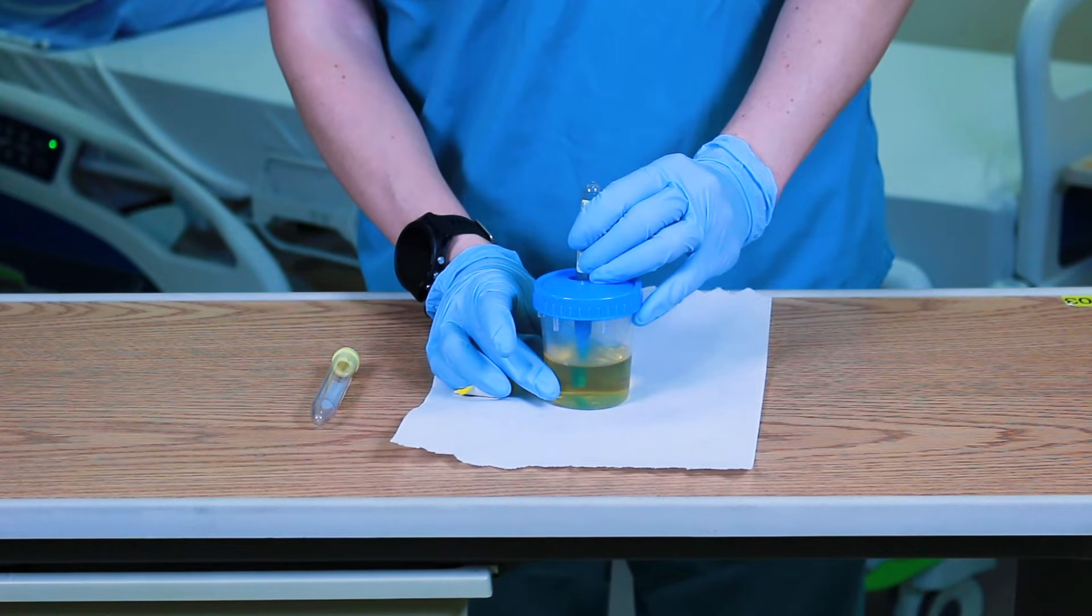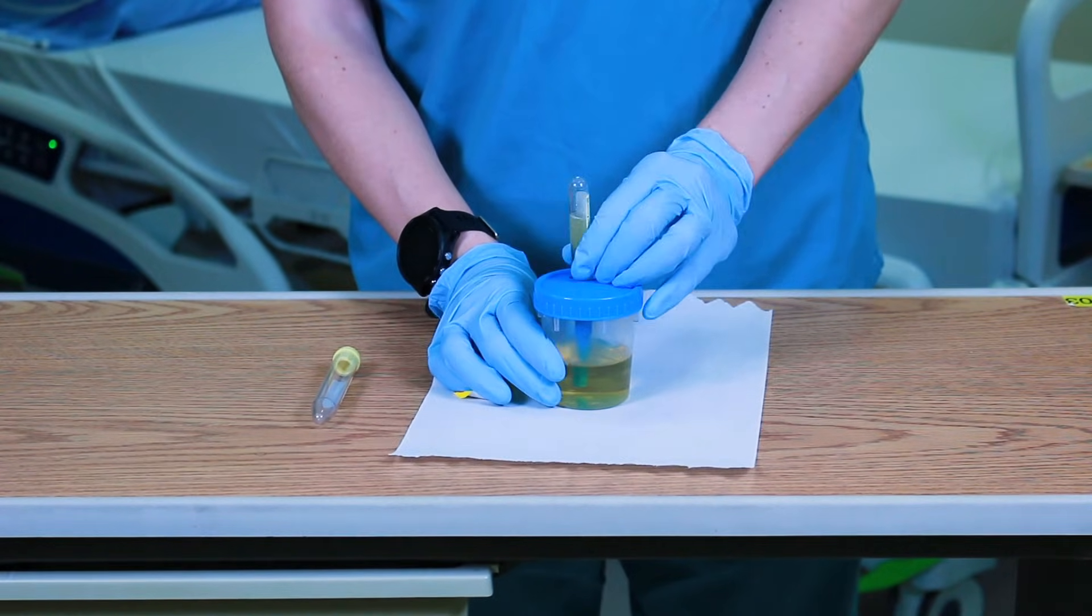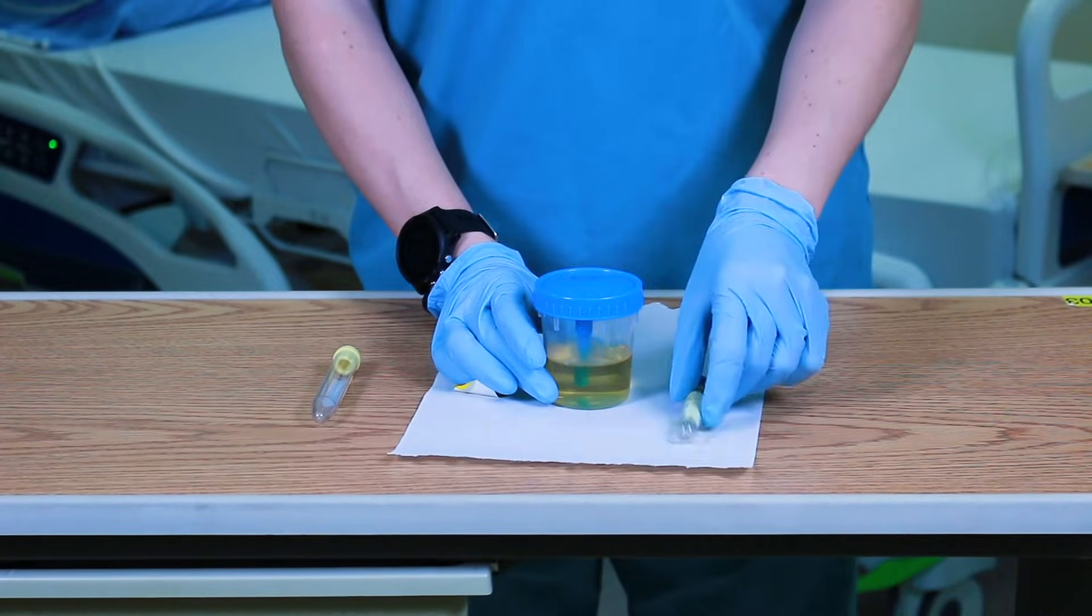Negative pressure will allow the urine to flow into your collection tube. If there is a preservative, invert the tube 8-10 times to mix.